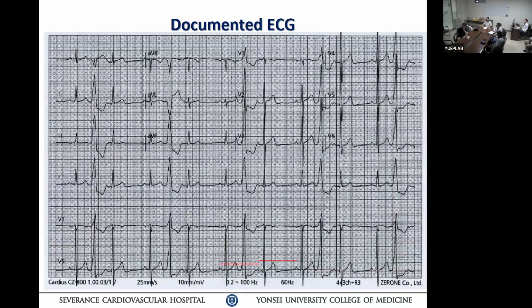Yes. Question. If you plan to ablate this, would you do endocardial mapping first and then CS mapping if there is no good target, or would you do the CS mapping regardless? Because by mapping, do you mean you bring diagnostic catheters or you do 3D mapping? Which one are you talking about?